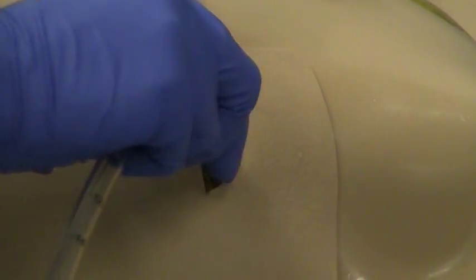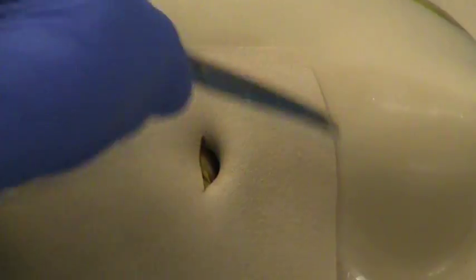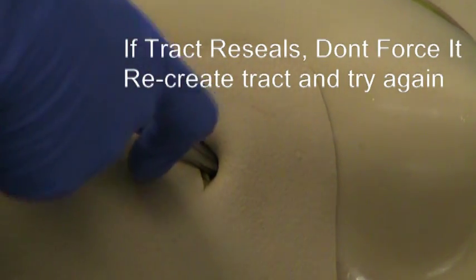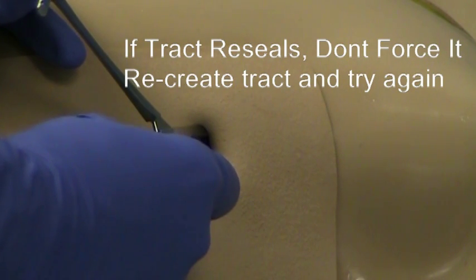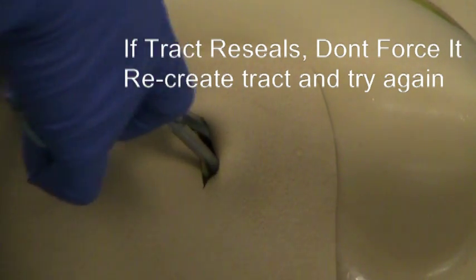As you can see, I'm having a little bit of difficulty with this, and that's because my track actually collapsed somewhat as I was talking and demonstrating. If I have any problem with that, I can go back in with my clamp and just dissect those tissues once again and try again.